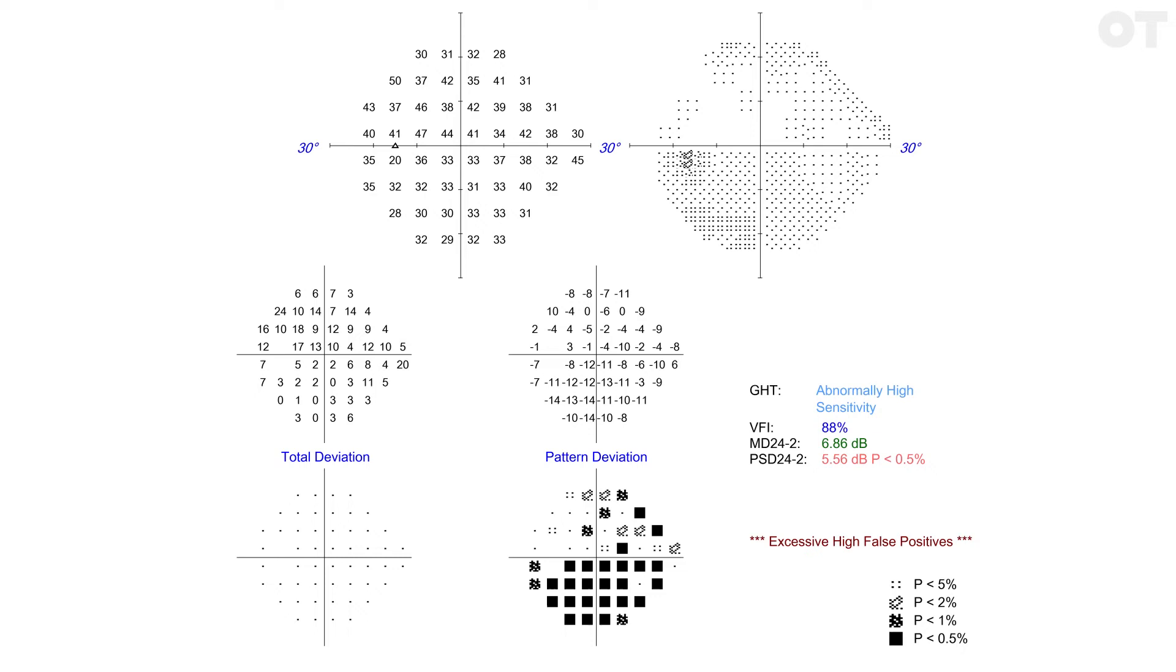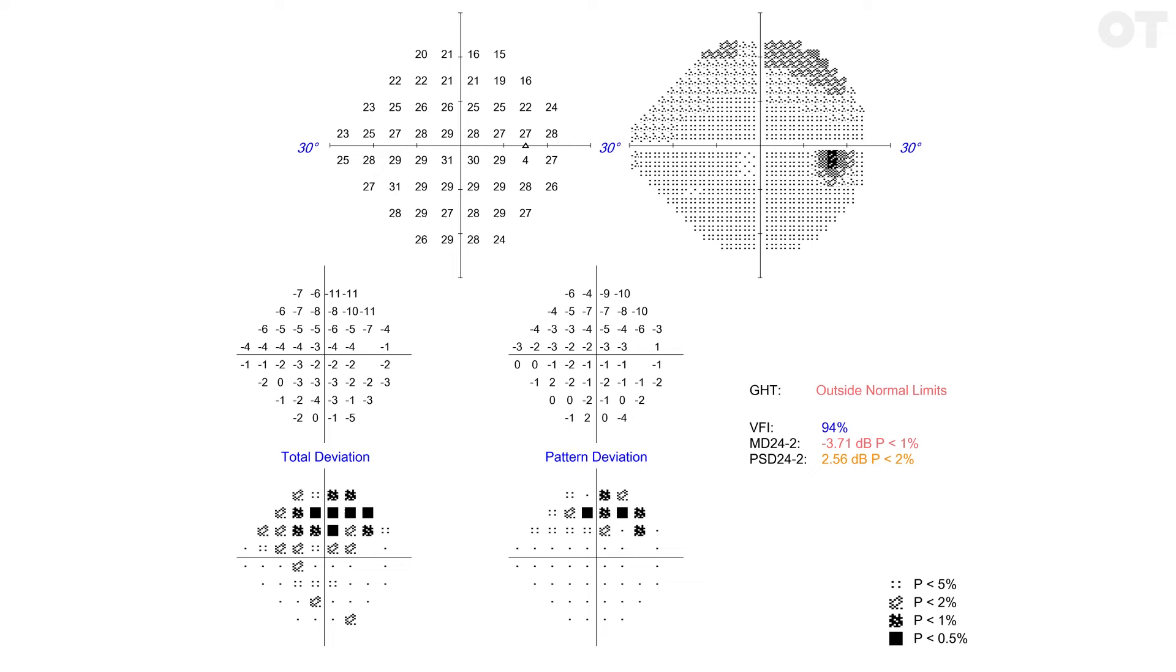If the two plots look about the same, there is no generalized depression. A defect that appears on both is more likely to be genuine.